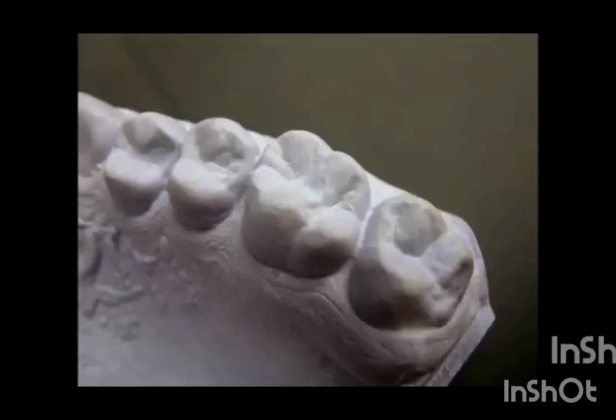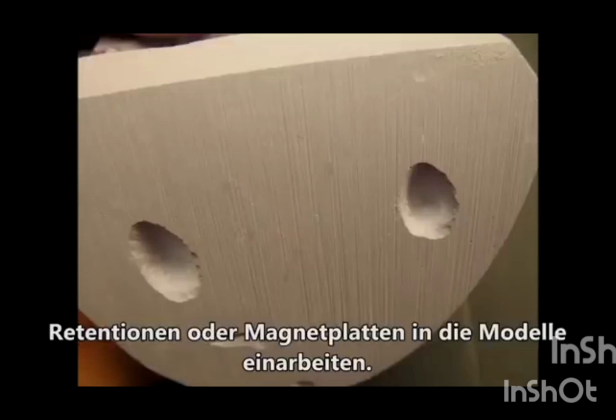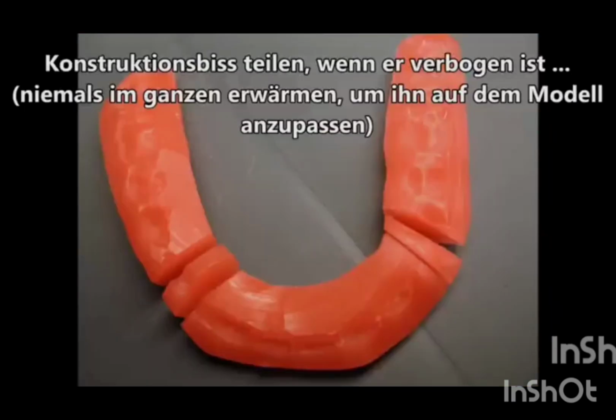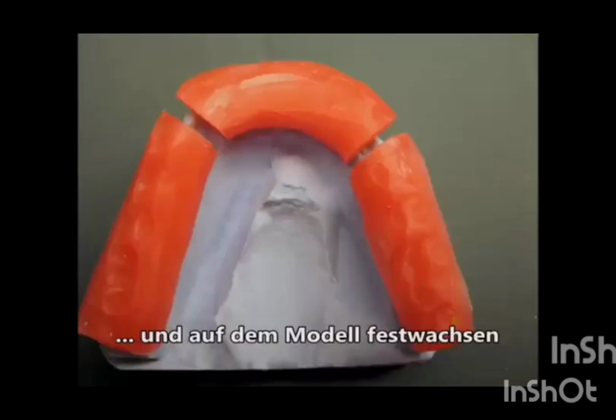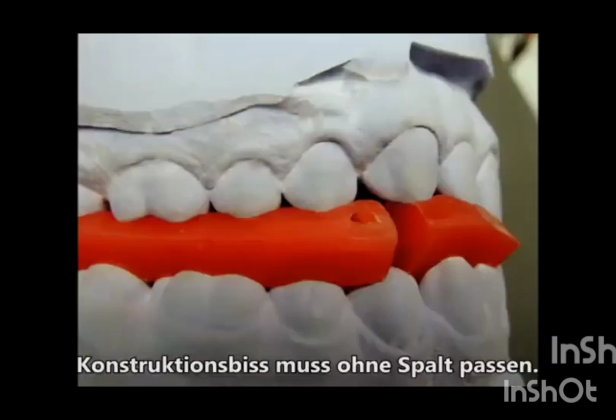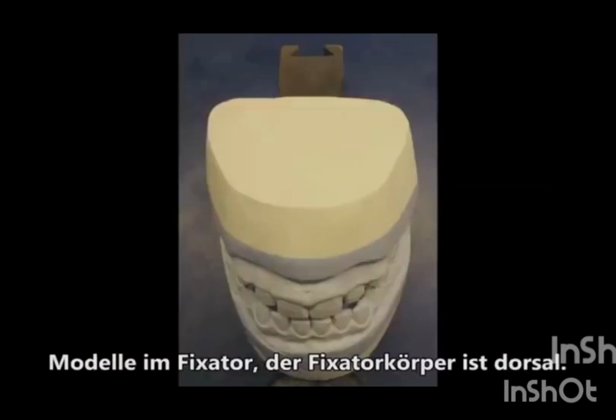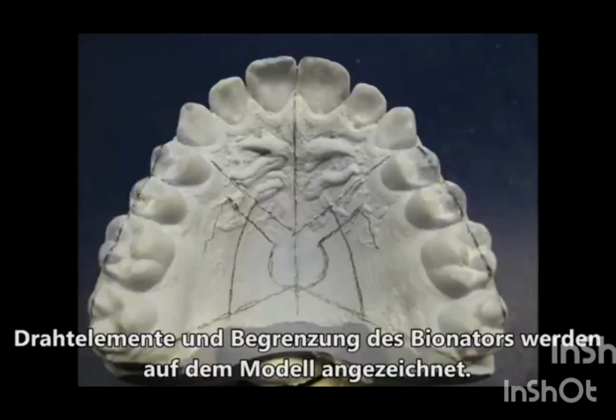Let's see the fabrication of the bionator. This is the wax bite that is recorded in the patient's mouth. It is positioned on the cast. Then it is articulated.